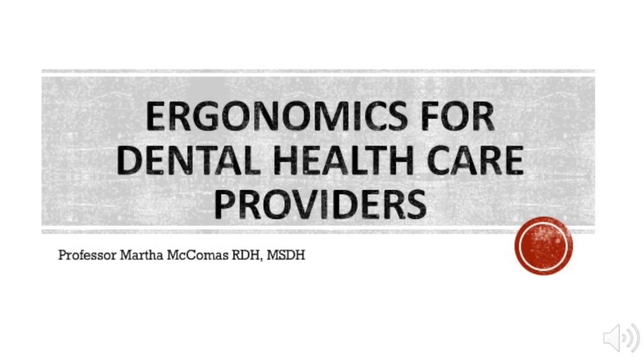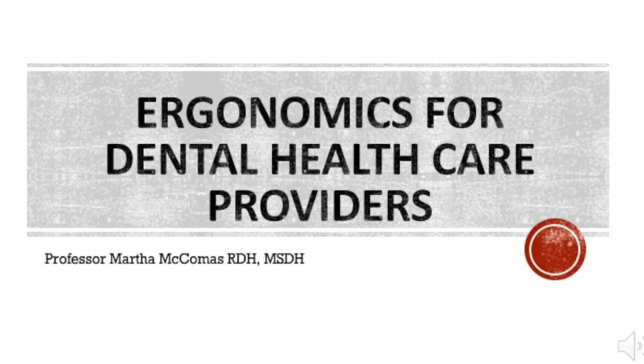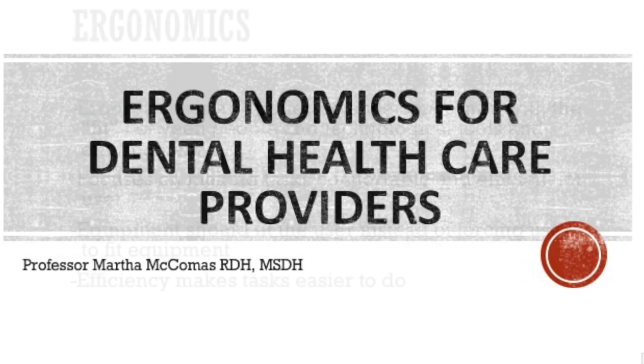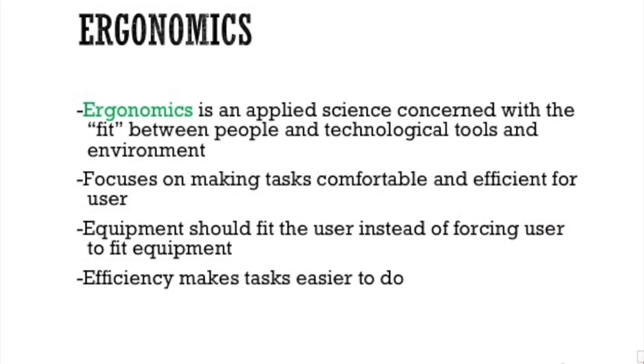This video is going to inform the dental and dental hygiene student about ergonomic positioning for patient care. It is imperative that the dental healthcare professional be mindful of their posture as to thwart off potential musculoskeletal disorders before they occur. Let's begin with a definition.